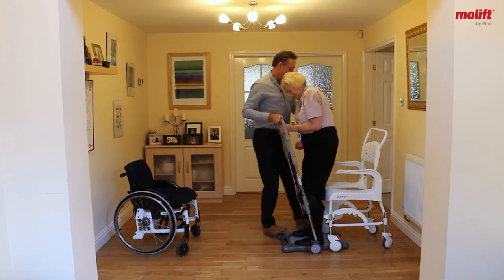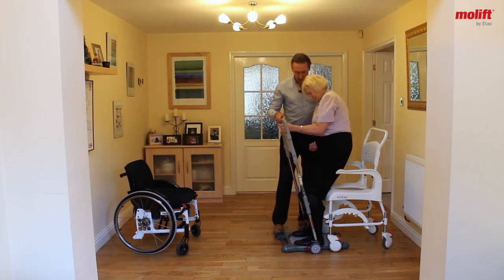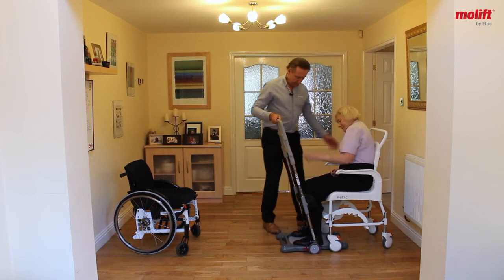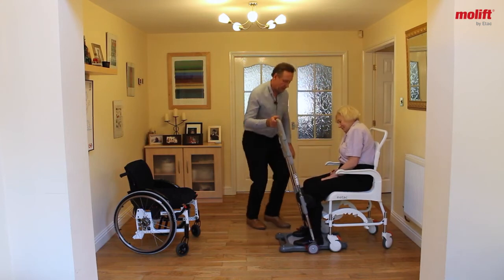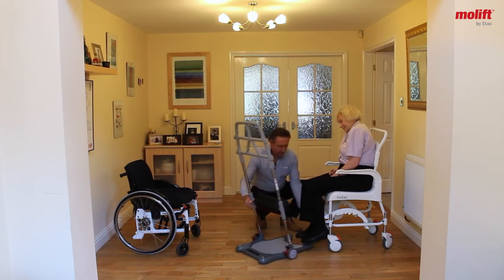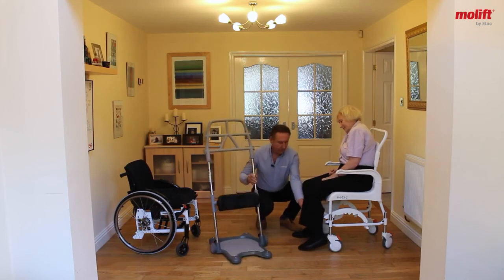Once again, if you sit down in the chair, I'll just remove this. You can lift that leg, and I'll just make sure that leg is positioned properly. All right. Here you go.